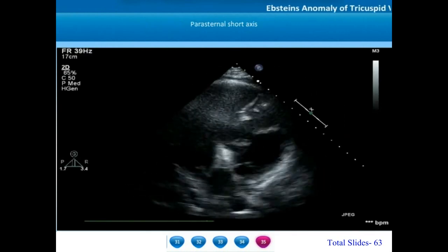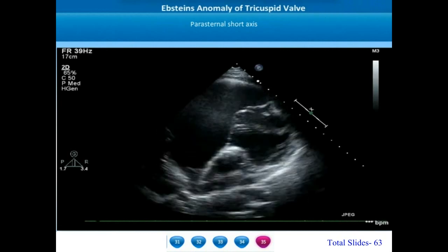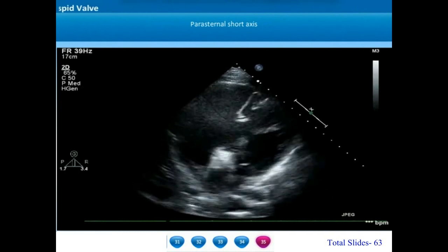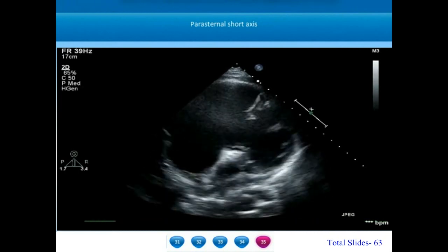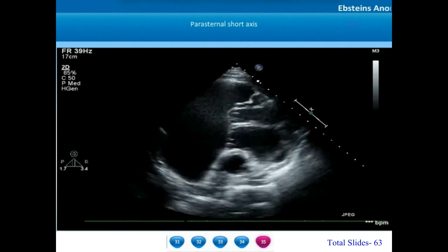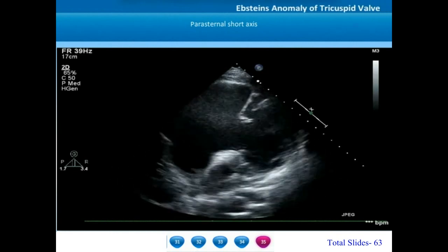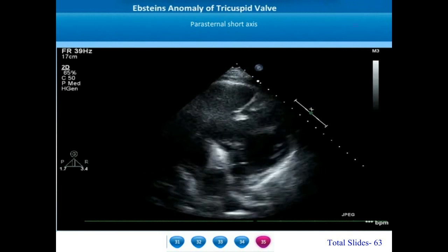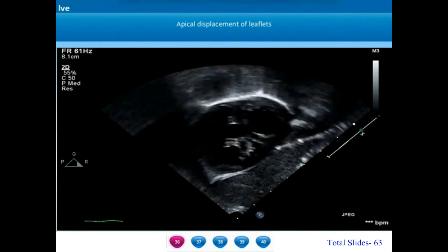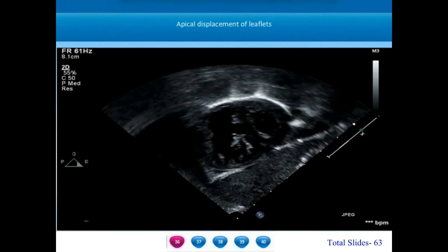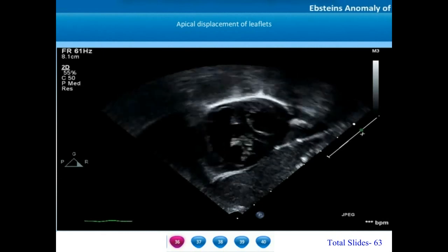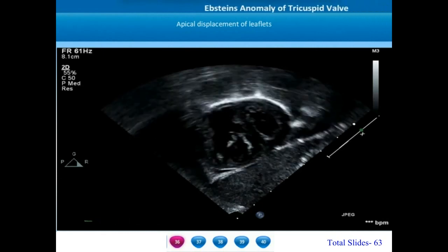On parasternal short axis, we can appreciate significant displacement of all the leaflets towards the apex. All the leaflets are well mobile; however, the orifice is directed towards the right ventricular outflow tract. This rotation of the tricuspid valve must be recognized before surgery. On a subcostal short axis view, we can also notice the apically displaced leaflets. As we sweep the probe more towards the left ventricle apex, we start appreciating the apically displaced septal and posterior leaflets.